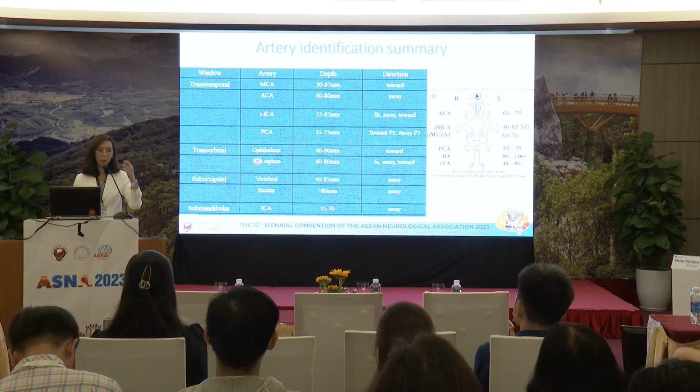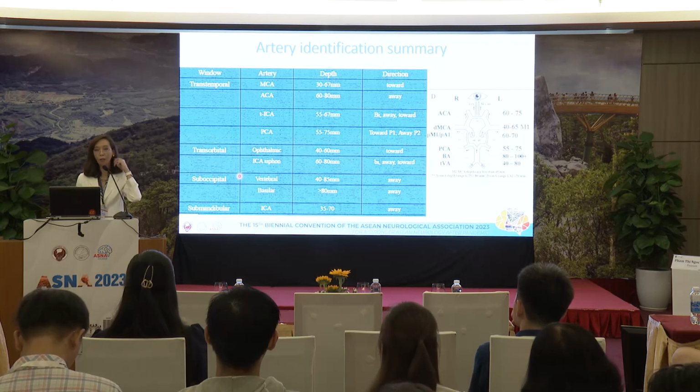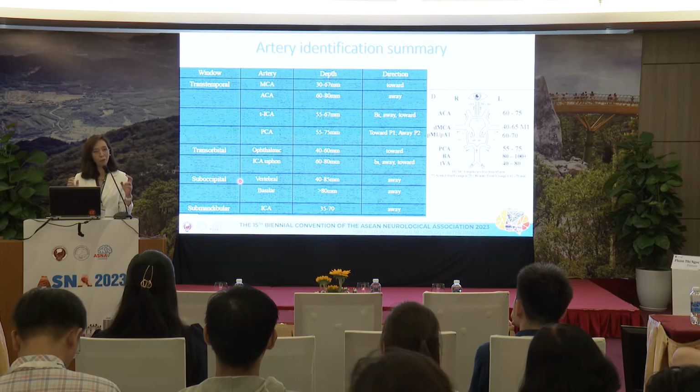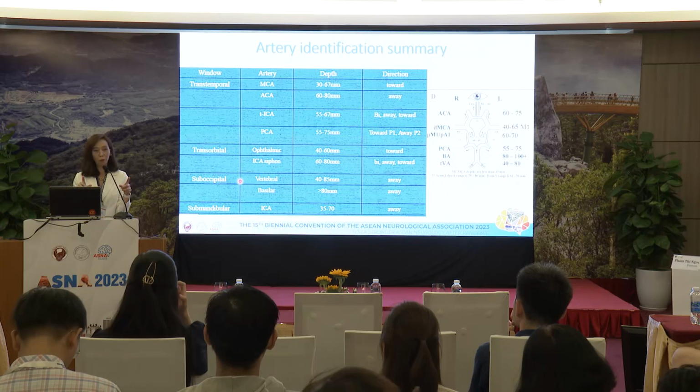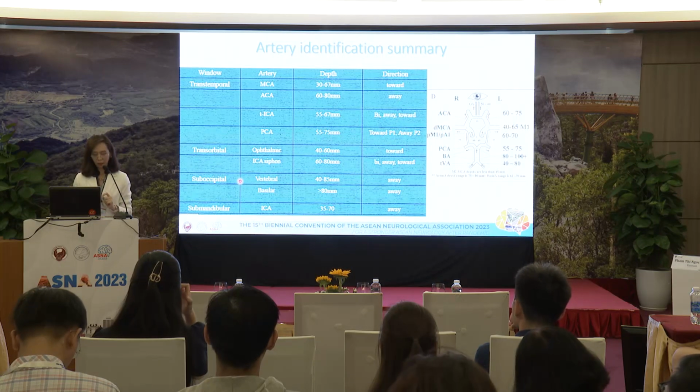And then for the occipital, put the probe at the back and try to find the vertebral and move further to the basilar. And the vertebral and basilar are moving away from the probe, right? Because we put the probe here, they are moving away from the probe.